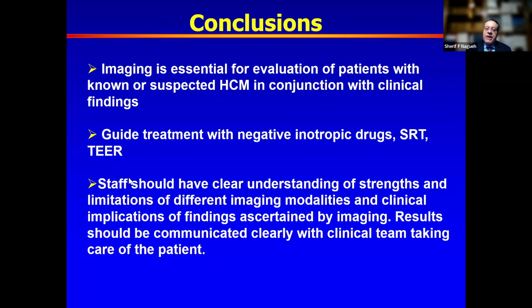If a reader is looking at a study and you are not able to dissect what is the actual peak gradient, and you have a complete MR jet and you have a good measurement of systolic blood pressure, you can include a statement in the report as to what you expect the gradient to be.